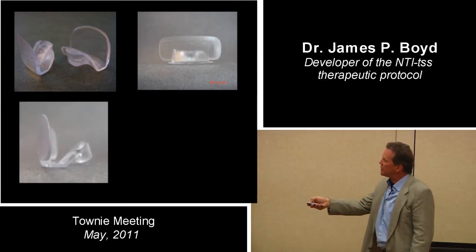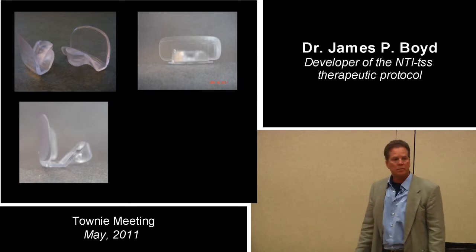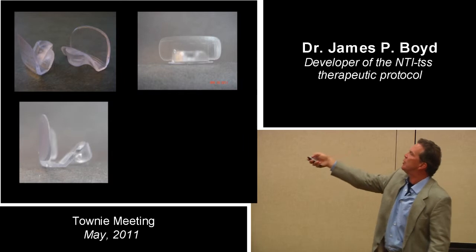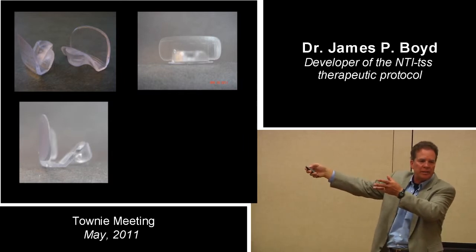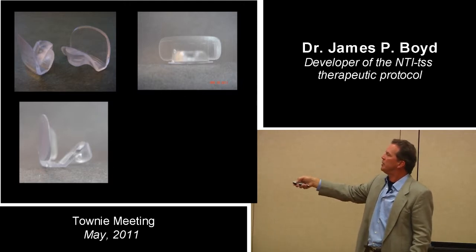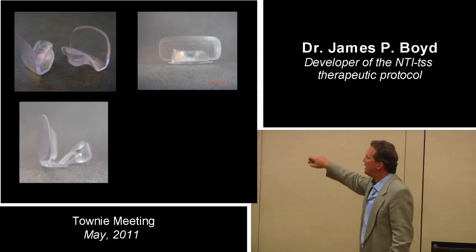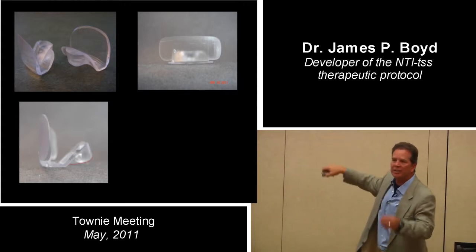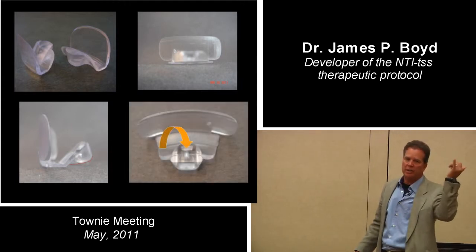And the discluding element has already been ramped up a little bit. Right now it's just one piece. I'm just showing what the old, this is two views of the same device. And what I'm doing is I'm using this in replace of that. I'm just showing you its design. Internally, there's a little undercut, little step, so that your thermoplastic locks in. There's no fear of it dislodging.